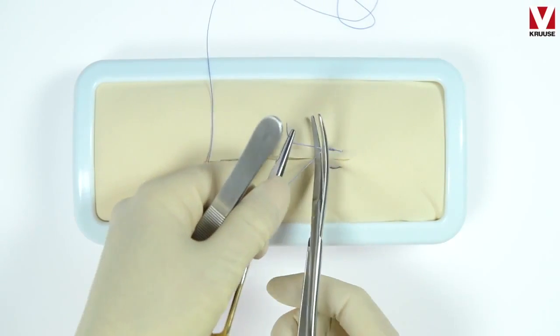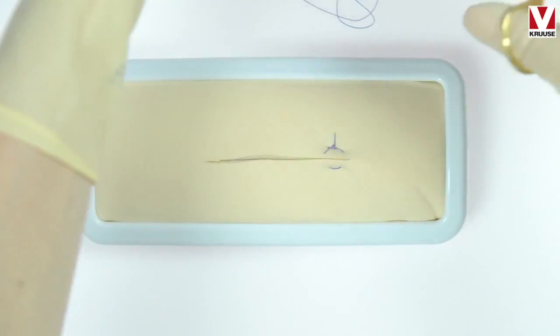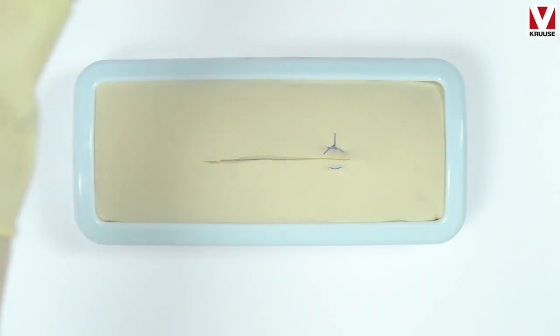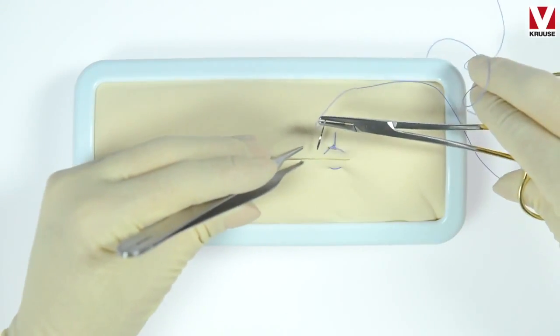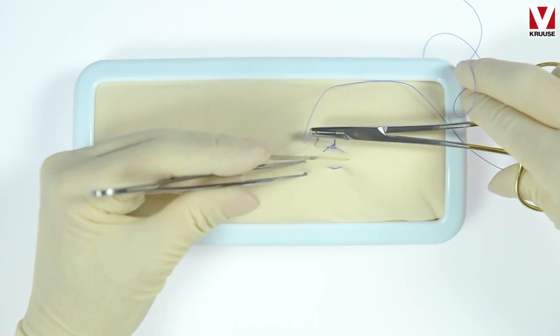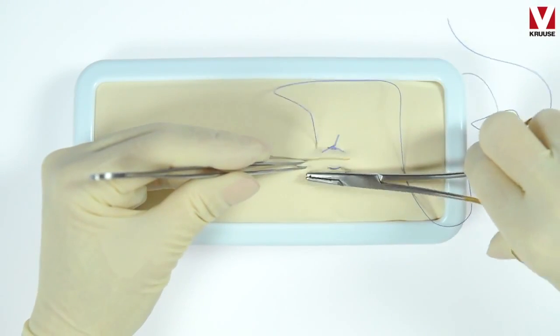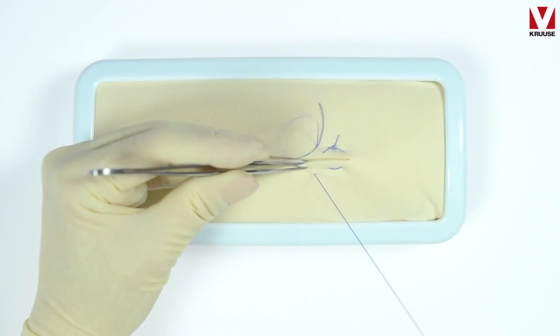When you're using this suture pattern for skin closure, please make sure to use a monofilament and non-absorbable suture. Here we go again, the far near and then near far. I'm not grabbing the suture with my needle holder.